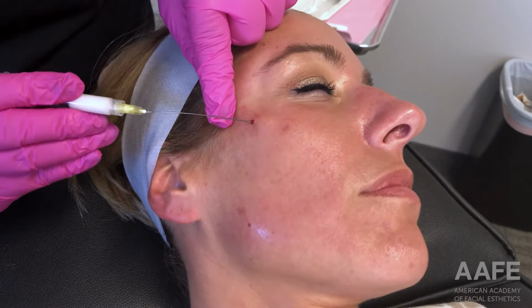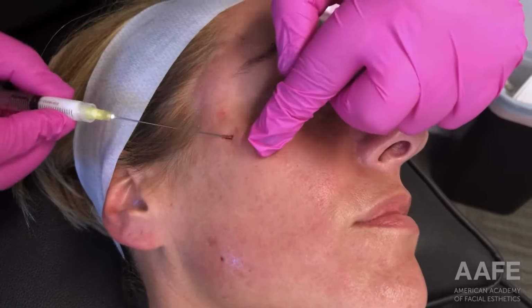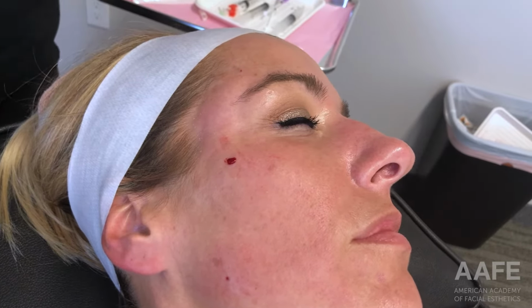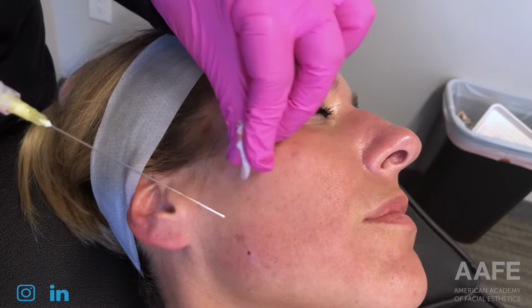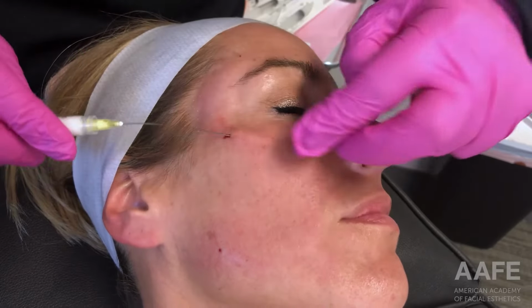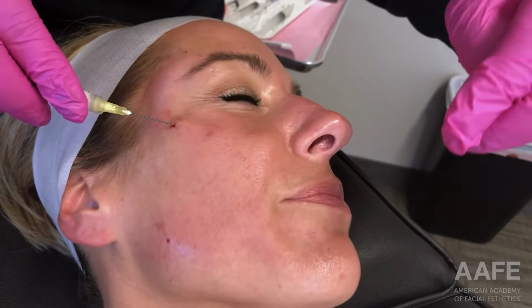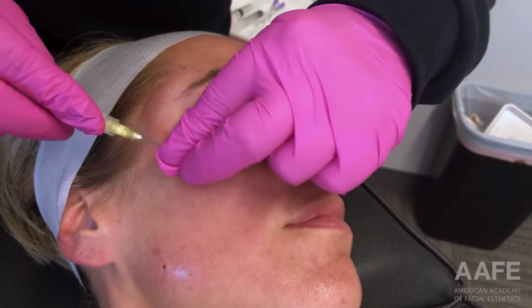Okay, we are going to move on to treatment of the upper face. So we've created essentially two entry points, one in the lower face and one in the upper face. And we're looking to just fan your product so that you're getting equal coverage all across the face. For this particular patient, we're looking for essentially global improvement. And so I want to make sure I have nice equal coverage of my cheek, my mid face, and my lower face. And so now we have entered along the zygoma with our Dilute Radiesse, again, a 1-to-1 ratio.